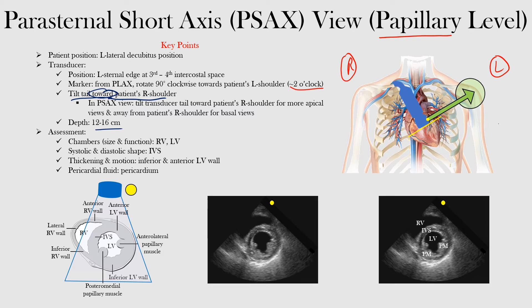Just to orient yourself, this is where the transducer is, and it's looking down. This here is the marker. So the transducer is looking down and what we're seeing here is the right ventricle, more towards the top. You can see that the right ventricle would be here — you're not fully getting the whole thing. And then the other chamber you want to see is the left ventricle, the other cavity in the middle. So the chambers we're seeing are the right and left ventricle.